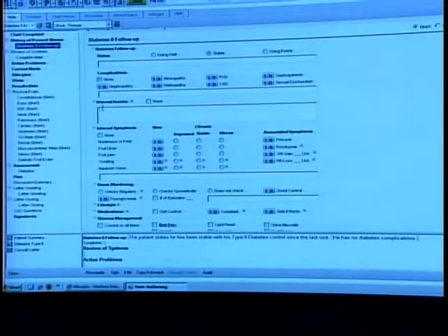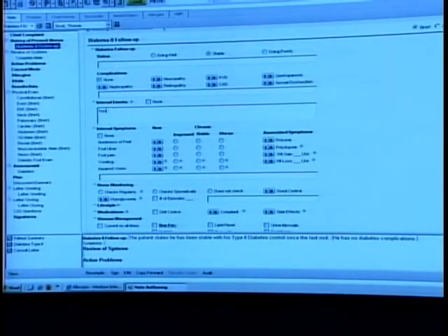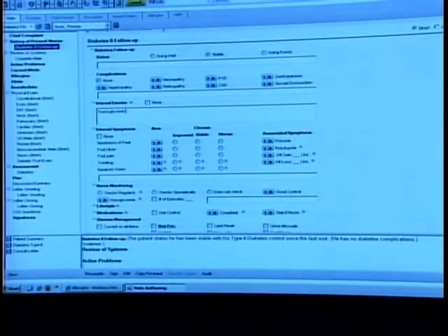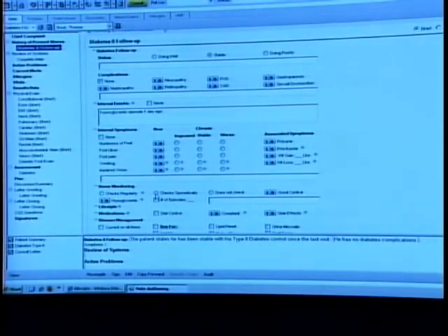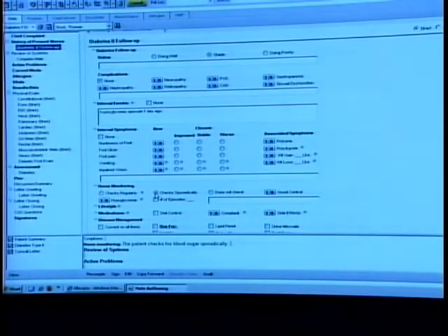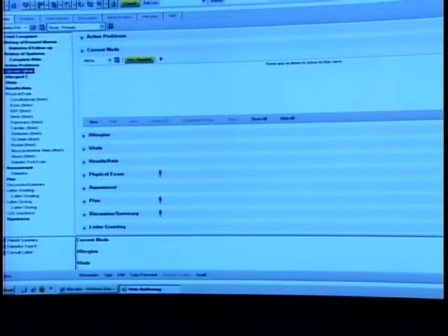And then for the interval events, hypoglycemic episode, 1 day ago, as an example. We'll say that he checks his glucose sporadically at this point in time. And for speed's sake, I'm simply going to give him a normal review of systems. We've got the system so that it automatically pulls in his active medical problems. Current medications, and notably here, there's none.